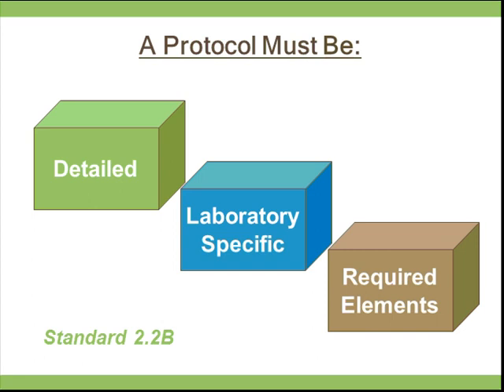A common error that laboratories make when applying for accreditation is to submit a copy of the equipment manufacturer's manual in lieu of a protocol. A manufacturer's manual is not lab-specific and does not define exactly how the lab performs the exam or for what reasons.